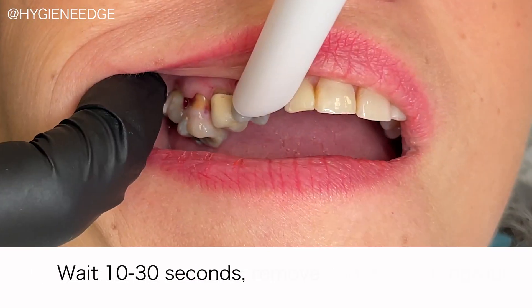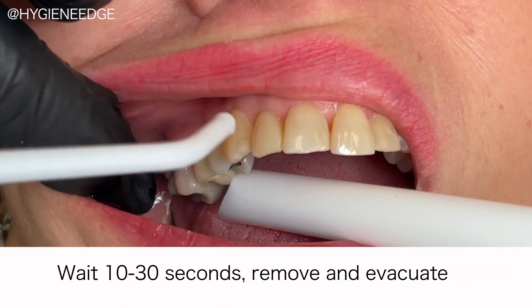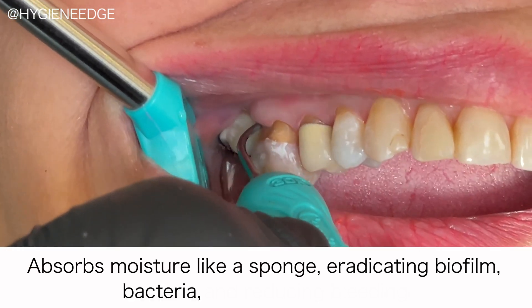It's nice that it comes out colored, so you can easily see where you've placed it, and it differentiates it from the blood. It works in less than 30 seconds, quickly absorbing the moisture like a sponge, eradicating that biofilm and bacteria.